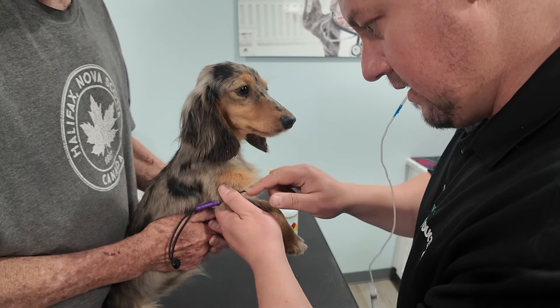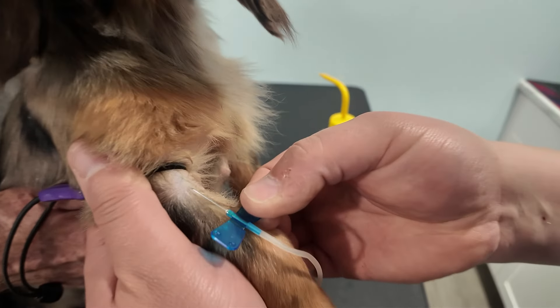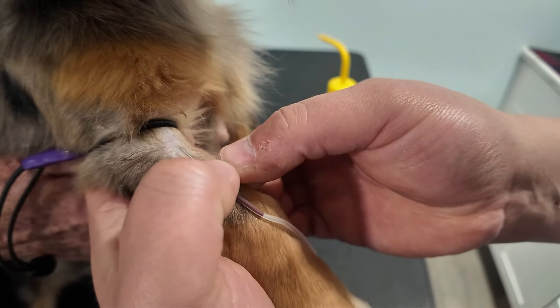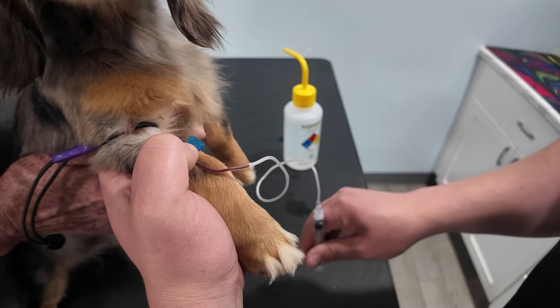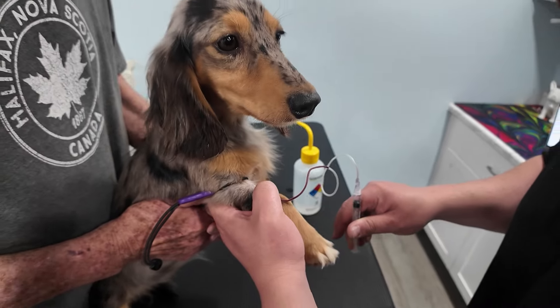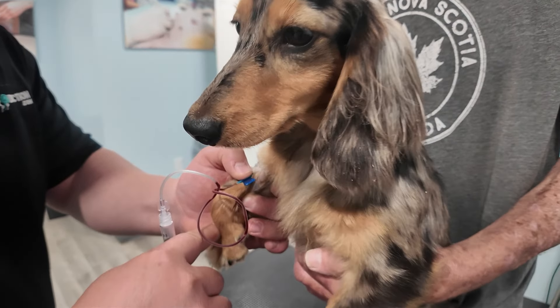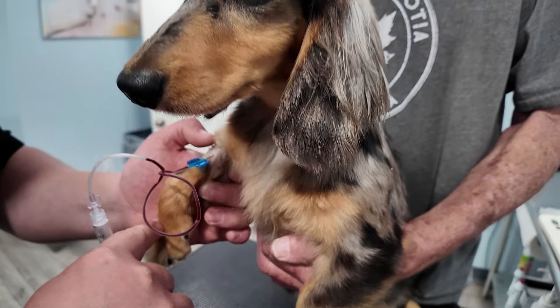Drawing blood from dogs with small or tortuous veins, like dachshunds, can be challenging. For this reason, we prefer using butterfly needles with a smaller gauge, such as 23G. The butterfly needle offers greater mobility during the draw, and the smaller gauge allows for smoother extraction from delicate veins.